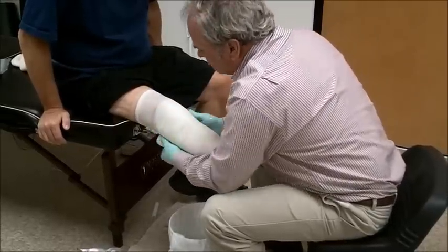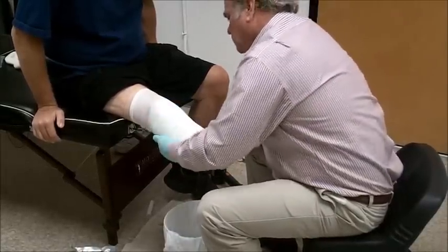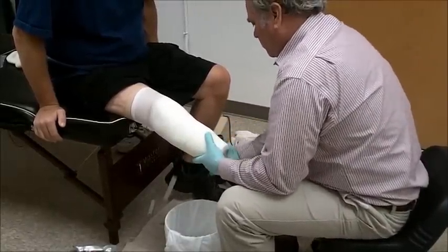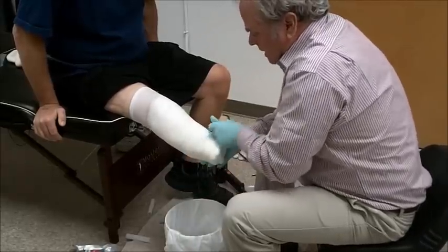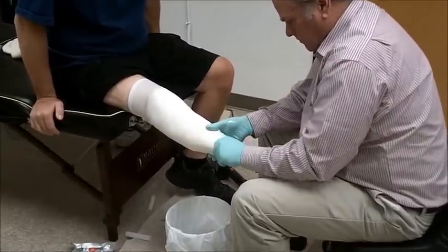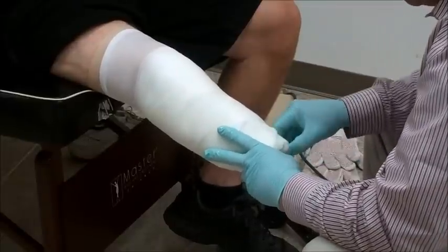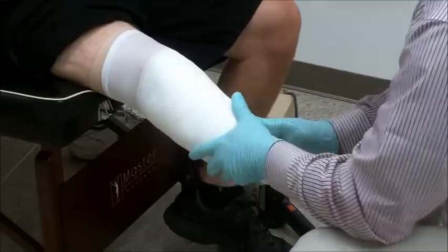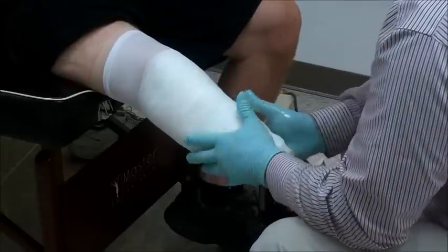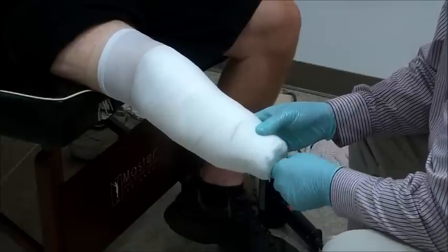I'm just trying to follow a little bit of my trim lines. Notice how much I can make this do an S-turn with this material. I also want this to be very strong, so I'm going to pull it extra tight down here in the bottom — just bring it in. C-form puts out an exothermal reaction, which means it gets hot or warm. When you feel it getting warm, that's when it will take shape. In the meantime, all you're doing is pushing resin around if you're trying to shape it when it's cold.